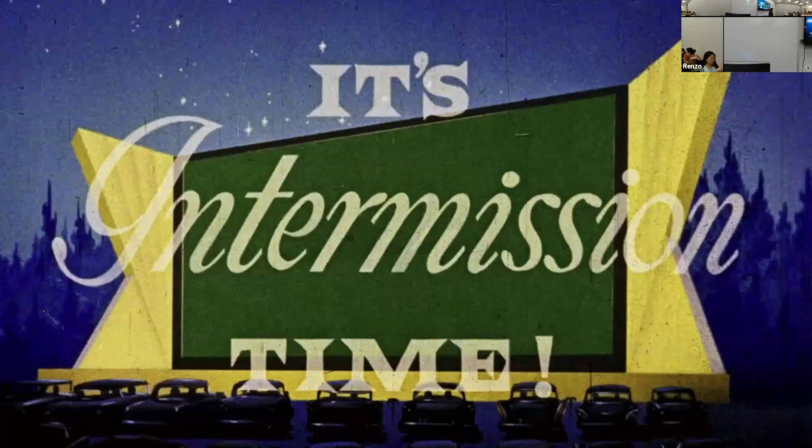Why 32 coils? I mean, why doesn't everyone just use 120? A couple different reasons. There are people who do explicit coil building here, and they'll be able to answer that better. One of the biggest things is that you're inside a giant magnet. There's not a lot of room.